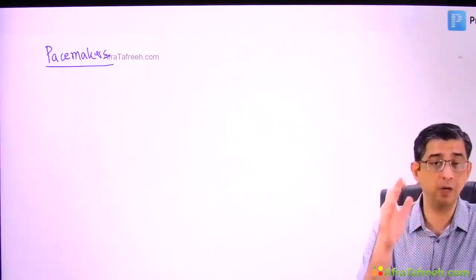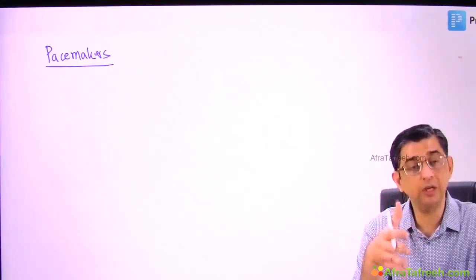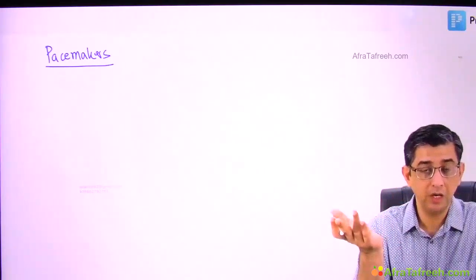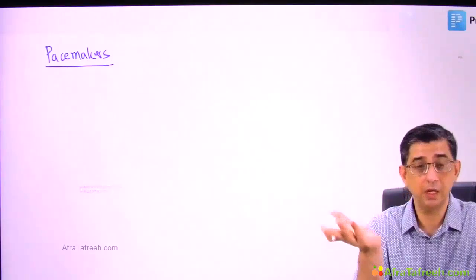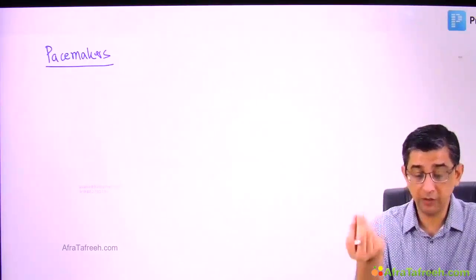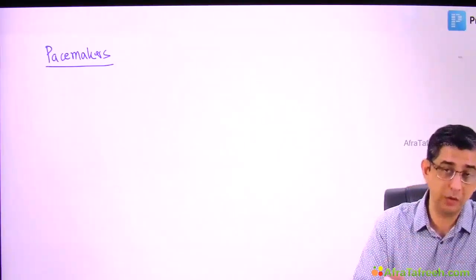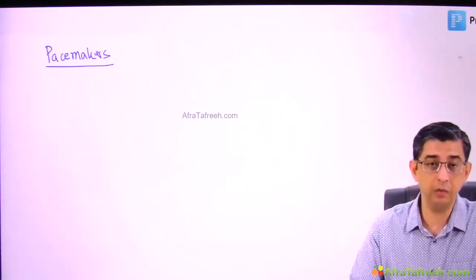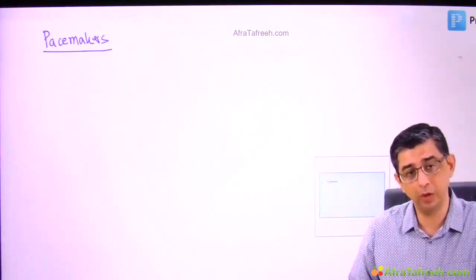So these patients were exempted from any kind of magnet-based devices which can actually interfere with the functioning of the pacemaker. But now, obviously, things have become much more advanced. We will have a person with a pacemaker going through airport security without a hassle. He can go to a mall, even though at every mall there might be metal detectors or scanners present. Or for that matter, he can keep his cell phone in his left breast pocket, because you see, a cell phone also has radiation. A cell phone also has electromagnetic waves radiating from it. Earlier, people were told to keep away from electronic devices, but with the current generation of pacemakers, there are absolutely no problems.